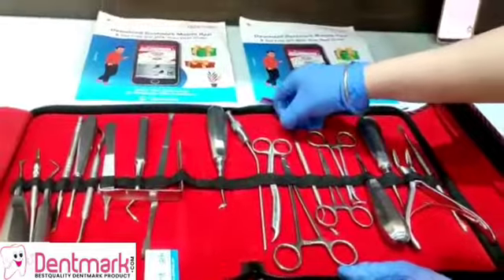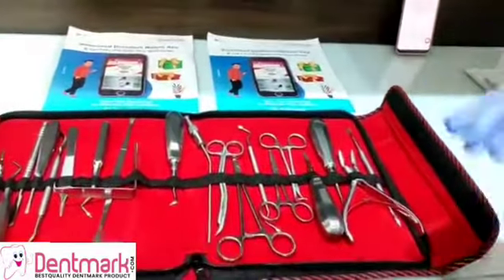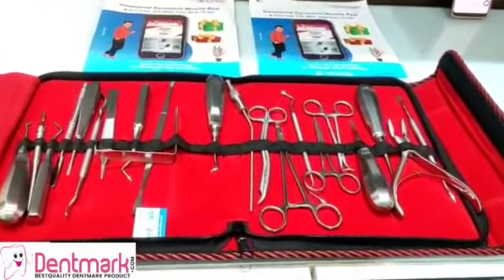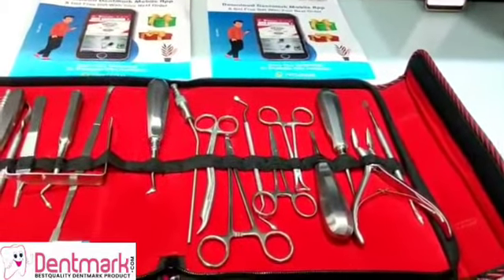This ergonomically designed kit is presented by Dentmark and it is autoclavable at 135 degrees. The various instruments which are presented in this kit are as follows.